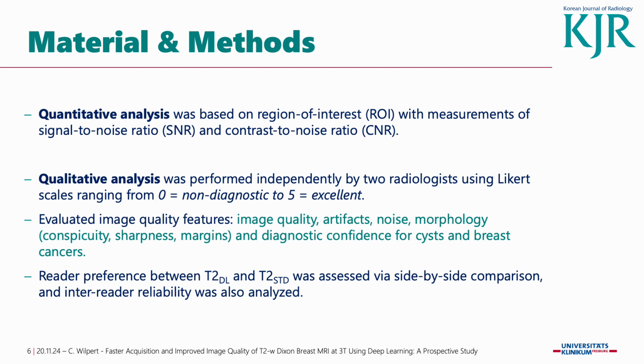For the quantitative analysis, we performed region of interest measurements for SNR and CNR. For the qualitative analysis, we performed ratings using Likert scales ranging from 0 non-diagnostic to 5 excellent, performed independently by 2 radiologists on diagnostic monitors.